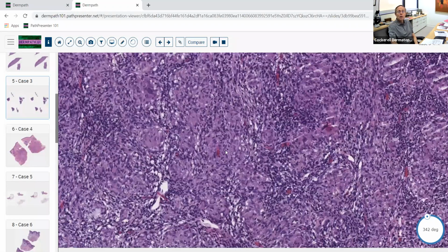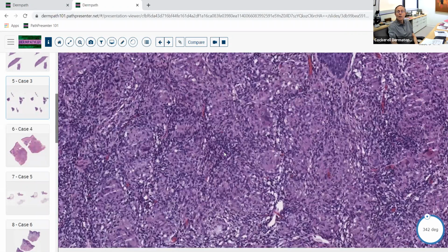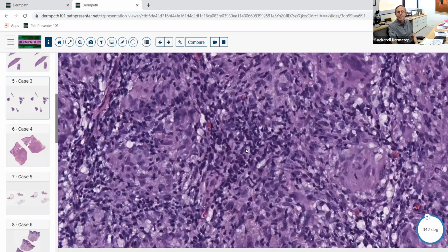We always talk about sarcoid giving naked granulomas. Well, I always like to say that it's almost like they still have their underwear on a little bit. There's usually a little bit of lymphocytic infiltrate in there as well. Sometimes it's purely granulomatous inflammation with no lymphocytes, but here there are obviously some lymphocytes as well.